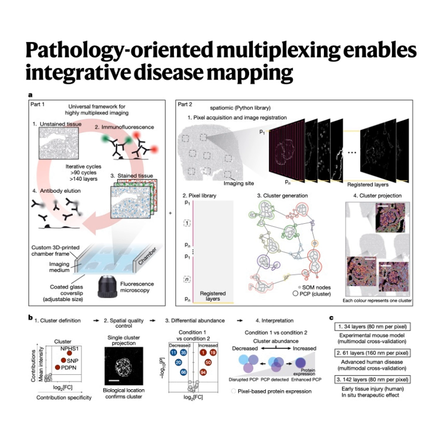So they could actually target and interrupt the pathological process identified by PathoPlex's cluster 21? That's pretty compelling. Let's pause for another quick recap on this finding. The concept: PathoPlex identifies clusters that go beyond just naming a cell type. They define specific functional states, like stress or activation patterns, with subcellular precision. The example: in kidney disease, CGN, PathoPlex pinpointed cluster 21, characterized by active PJUN signaling. And crucially, it located this cluster primarily in parietal epithelial cells, PECs, the key drivers of crescent formation.